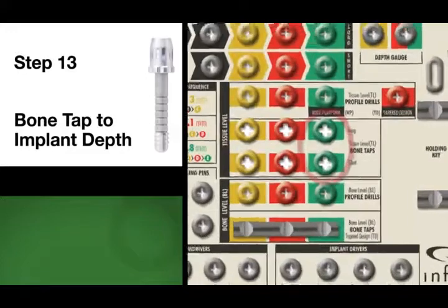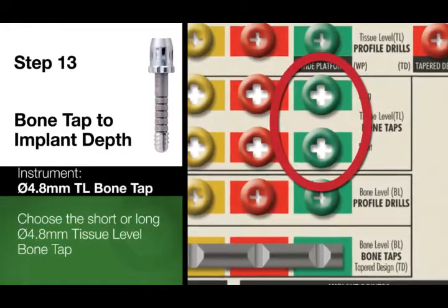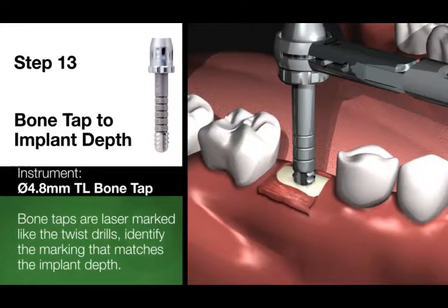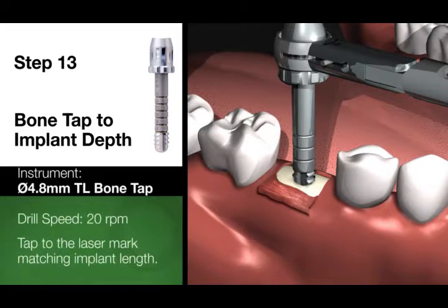Bone tapping to implant depth. Choose the 4.8 mm tissue level bone tap. Identify the laser marking on the bone tap that matches the implant depth. Cut the threads into the osteotomy to match the implant depth. Tap at a slow speed not to exceed 20 RPM.